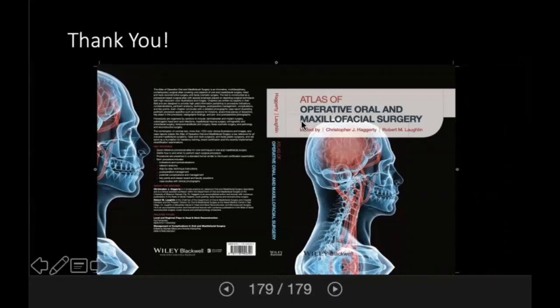The second question Dr. Yassin has is why you did not put xenograft bone in the sockets after extracting the anterior lower four teeth. The reason for that, of course, is because those areas will heal fine on their own, and those areas didn't have any dental implants in them. Now, if I was doing immediate implants, and if I had 1.5 millimeters or greater space between the implant and the buccal or lingual plate of bone, then yes, I would place some xenograft and graft that gap. But because we didn't have any implants in the areas where the teeth were extracted, in Paul's case, the gentleman from the PowerPoint, those areas will heal fine on their own. They won't have any pressure on them from the implants. It's just an additional step that's not indicated.